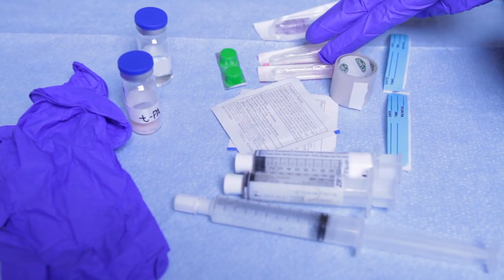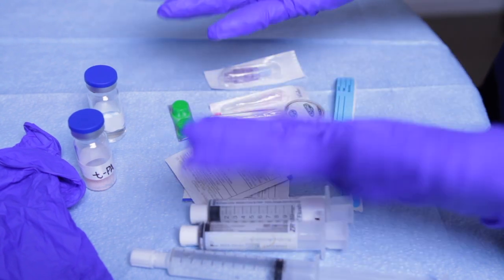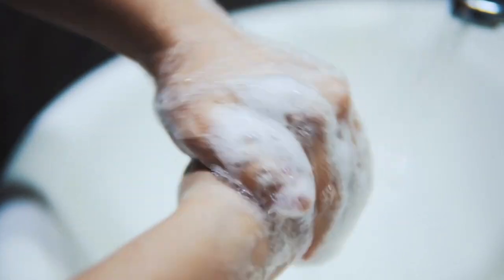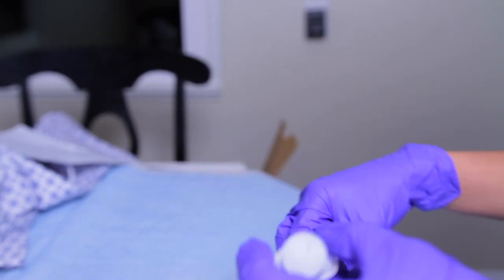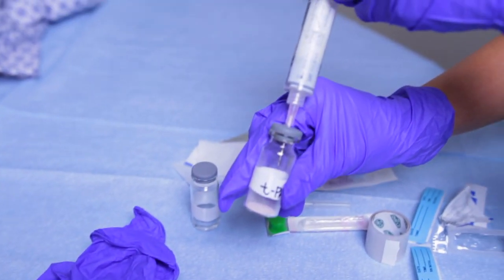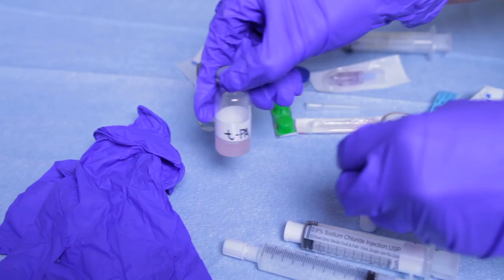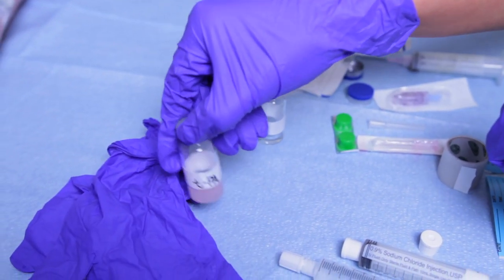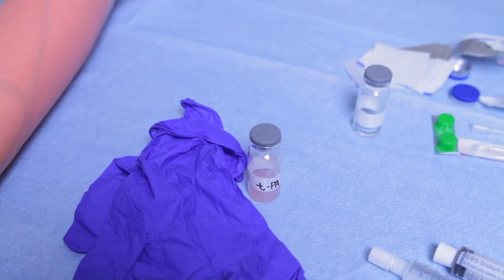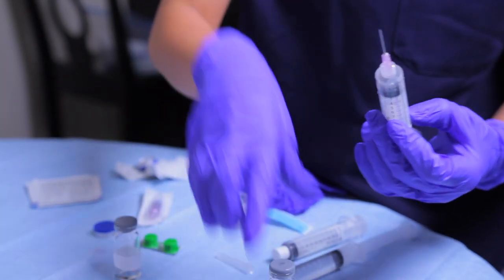You'll also need two 10-mil syringes and two needles, one pre-filled syringe with 0.9% normal saline, one needleless hub connector, a few alcohol preps, gloves, labels, plastic tape, and your biohazard bin. To prepare: start with hand hygiene — always wash your hands and apply gloves. Step one: withdraw 2.2 mils of sterile water and add it to the vial to yield two milligrams per two mils. Avoid using bacteriostatic water. Step two: gently swirl the vial to allow the drug to mix and the contents to completely dissolve. Allow three minutes and do not shake. Step three: draw up the ordered dose of two mils into a new sterile syringe and label the medication.